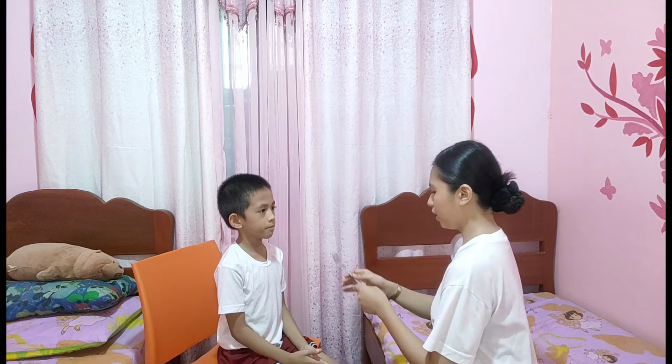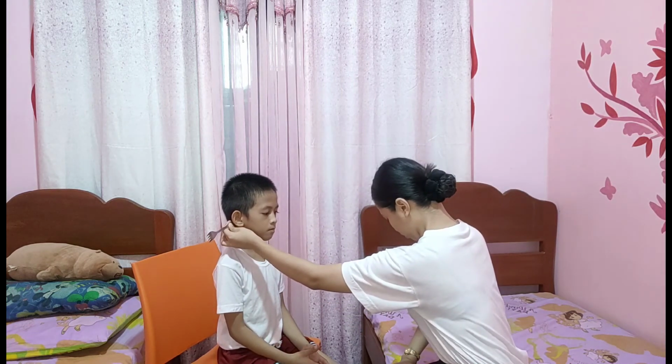Sir, now let's proceed to the bone conduction. I will place the tuning fork behind your ear. I will just lightly point this, then tell me if it stopped, just like the earlier procedure. Are you ready, sir? Yes. Okay. It stopped. Okay, 16 seconds.